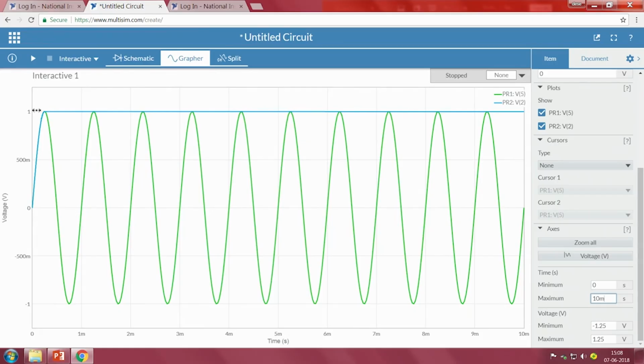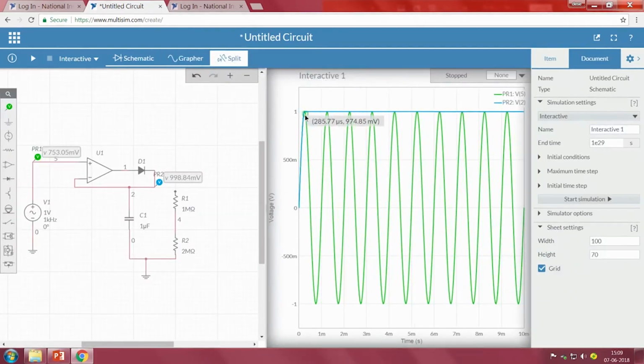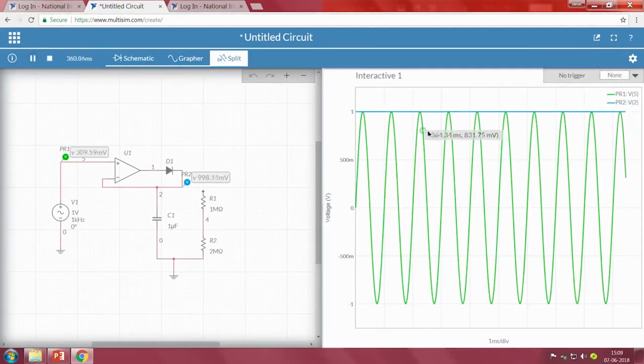What if I change my input? If the input voltage is 2 volts, slowly again the capacitor starts charging to the 2 volts value. Why do we not see that? The whole idea of this circuit is to find out the peak value, and whether the purpose is solved or not, let me check. So, let me run continuously.